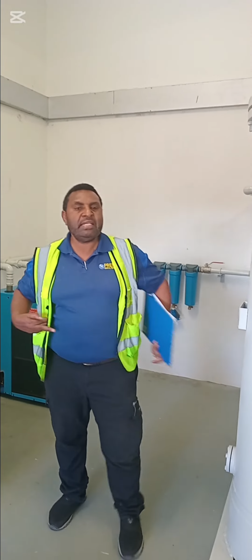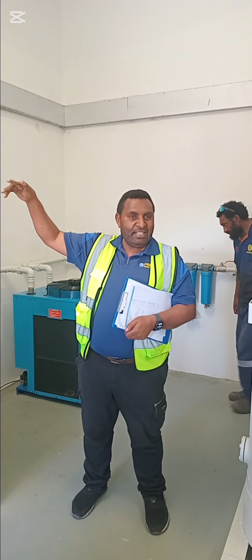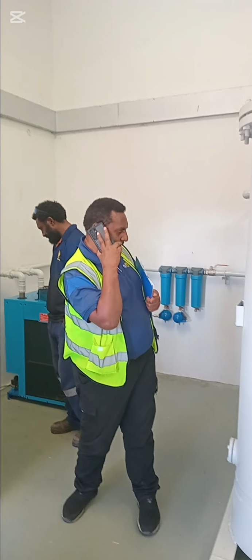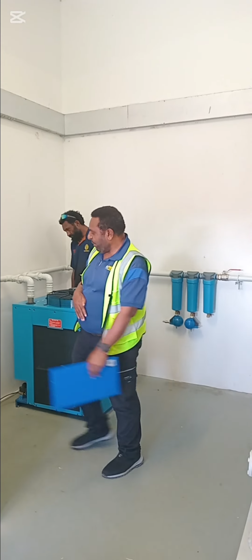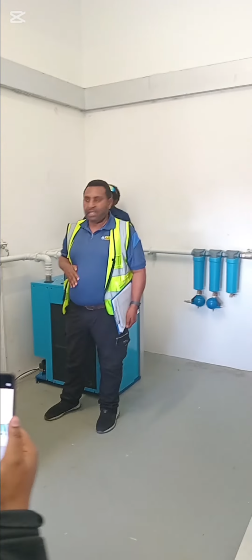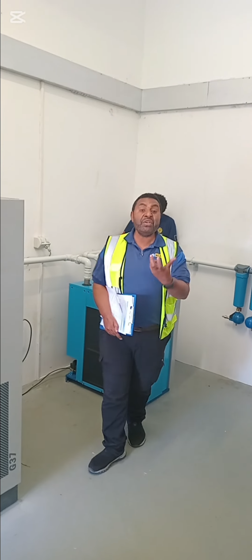When air is compressed, what happens? When you compress things, it produces heat. That's what we were basically saying in refrigeration. The compressor output has high pressure and it's got heat. The compressed gas heats up. But when it compresses the air, it also creates moisture. So this filter is filtering two things: the dirt that is compressed through the compressor, and the moist water that comes with it.